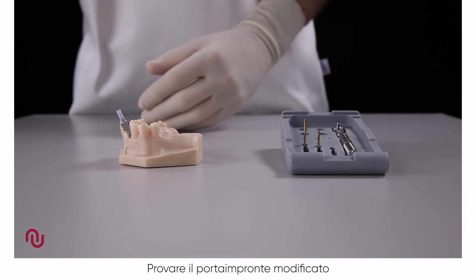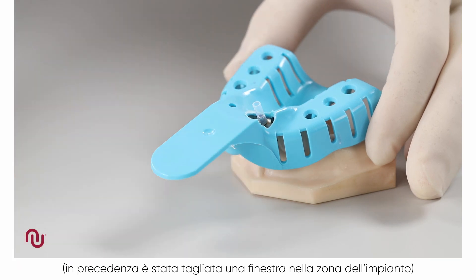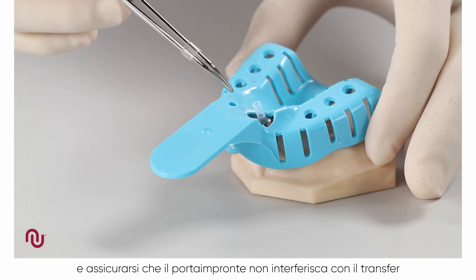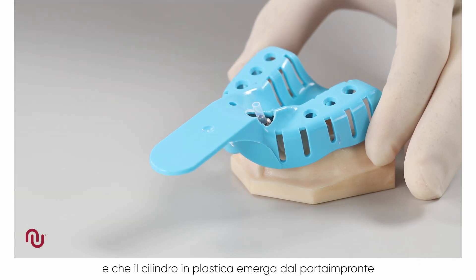We then try in the modified impression tray. A window has been previously cut in the area of the implant. Ensure that the tray is clear of the impression coping and that the plastic tube extends beyond the impression tray.